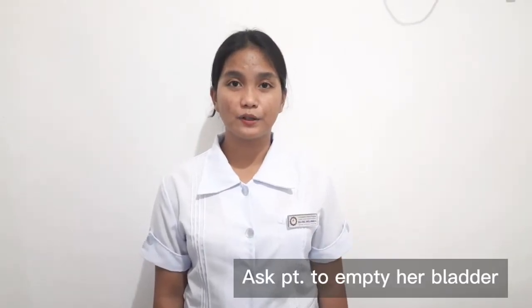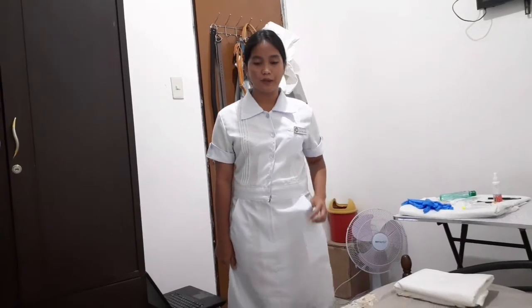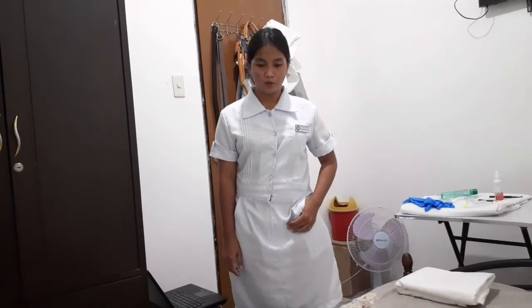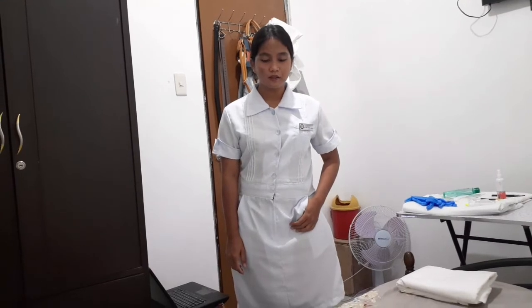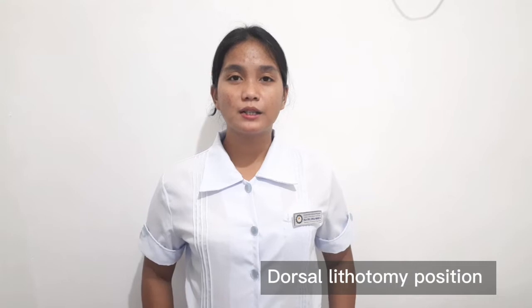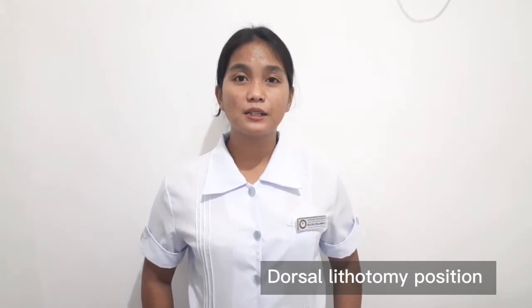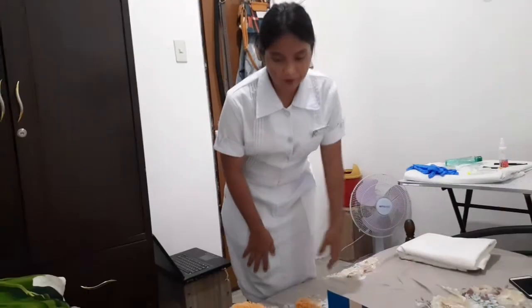Also, you can ask the patient to empty her bladder before the procedure. If you'd like to go to the bathroom to empty your bladder, please do so. No, thank you. Okay. Then, assist the patient to lie on her back, or instruct the patient to lie on her back in a dorsal lithotomy position. Now, let me assist you to be in a dorsal lithotomy position.